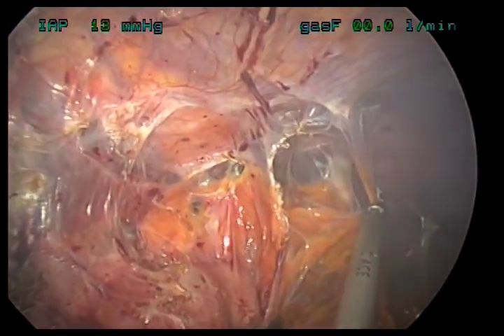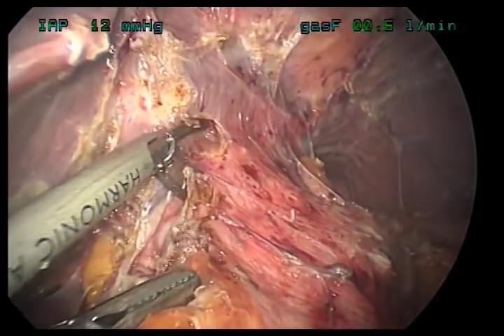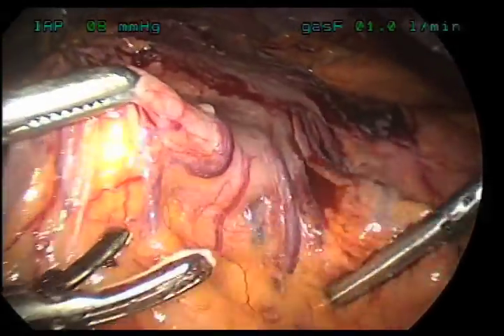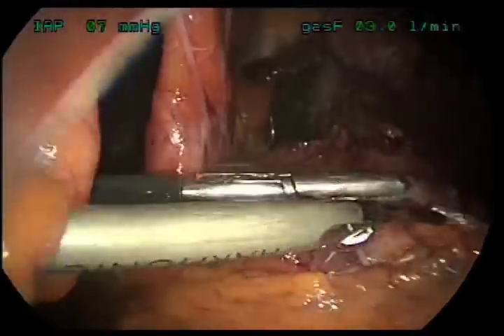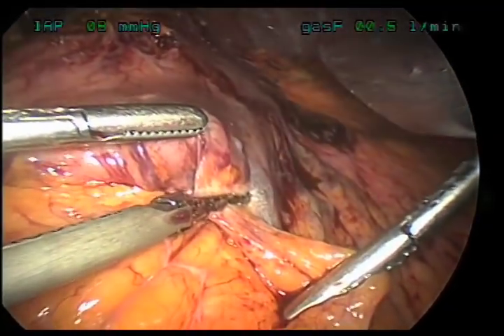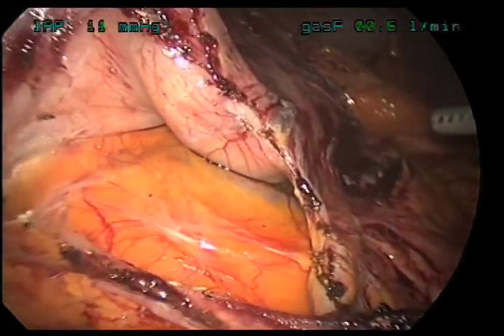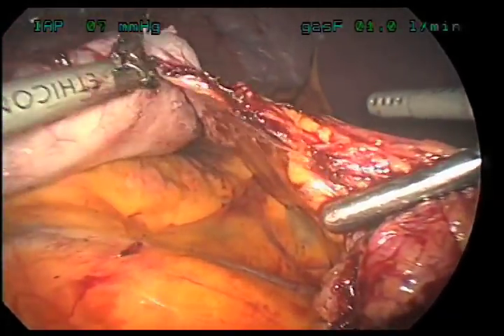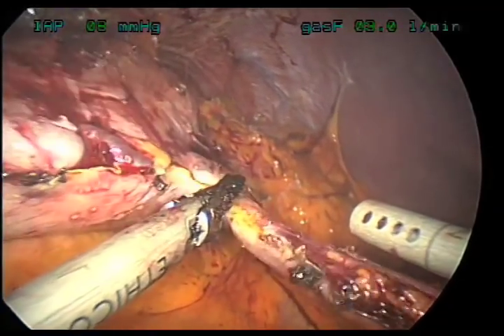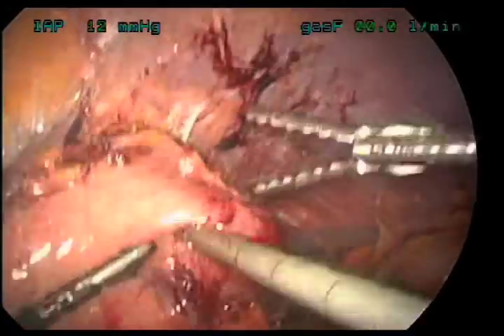Here we're taking down the old scar tissue using the harmonic scalpel — taking down scar tissue that attaches the stomach to the liver on your left and the stomach on your right. Once finished, we turn our attention to the greater curve of the stomach — the part on the right with blood vessels attached, running through fat called omentum. Using the harmonic scalpel, we divide those blood vessels in the omentum and enter the space called the lesser sac behind the stomach. We follow the lesser sac, taking down all the short gastric blood vessels all the way up until the stomach meets the esophagus.